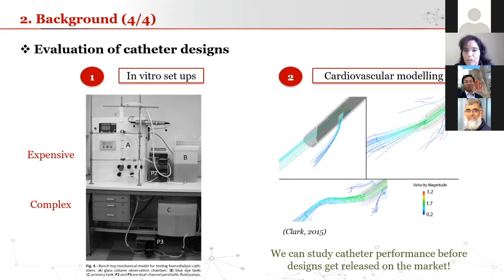The problem is that some studies use models to study catheters, but they don't take into consideration the right atrium. They just model the catheters inside simple tubes.